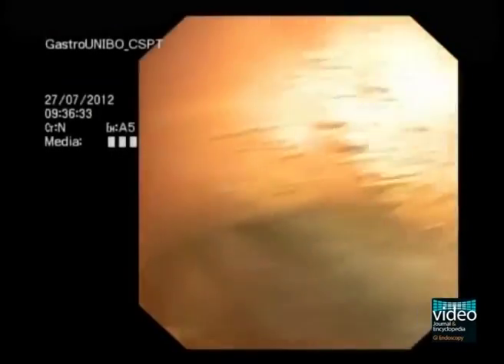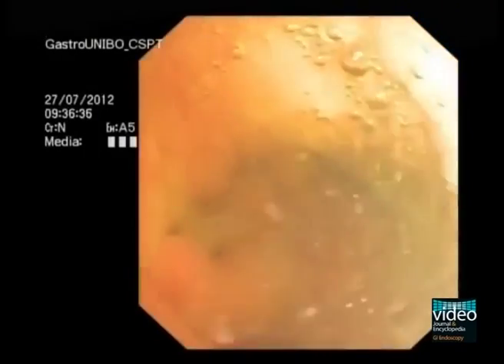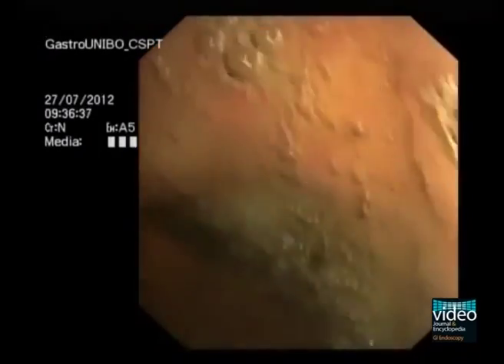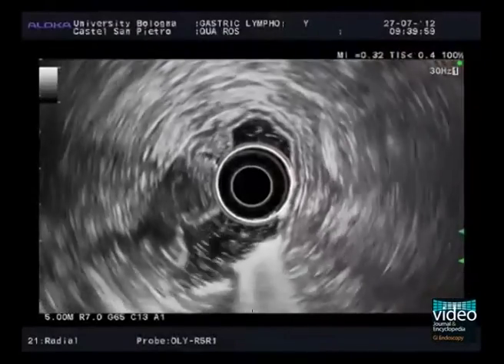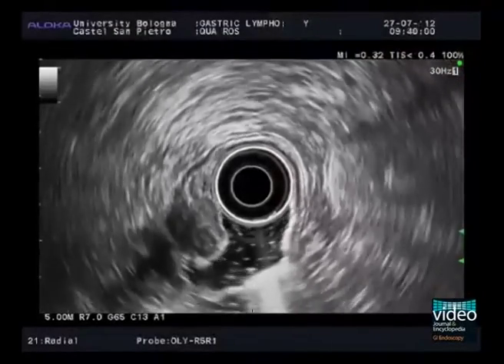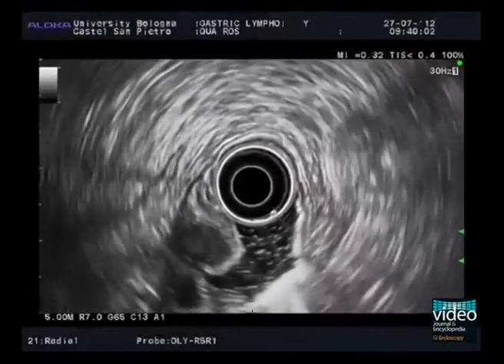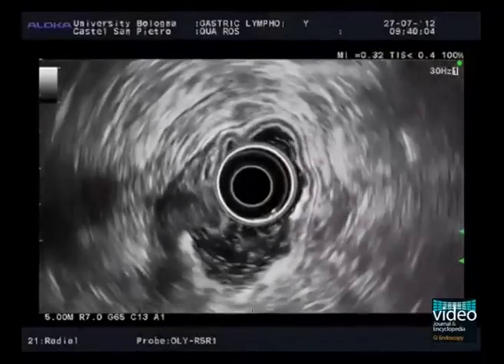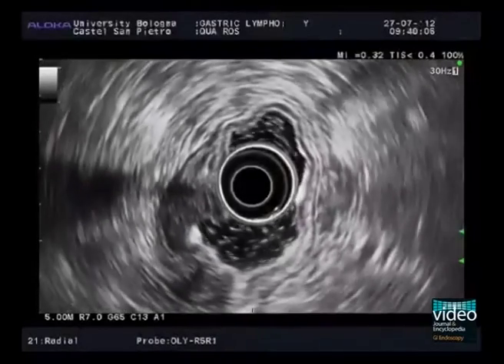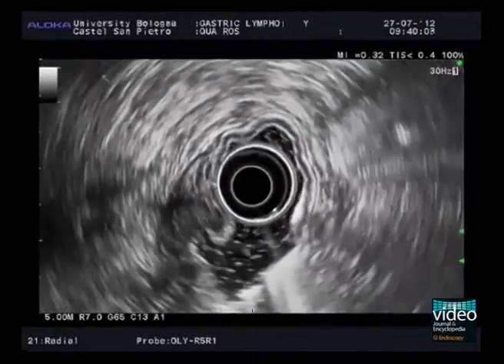Once water filling has been completed, EUS imaging begins in front of the pylorus. EUS is performed with an electronic radial scanning echoendoscope. The lesion is seen at the 9 o'clock position as a hypoechoic mass infiltrating the gastric wall.